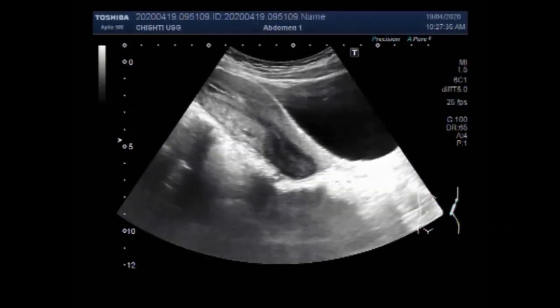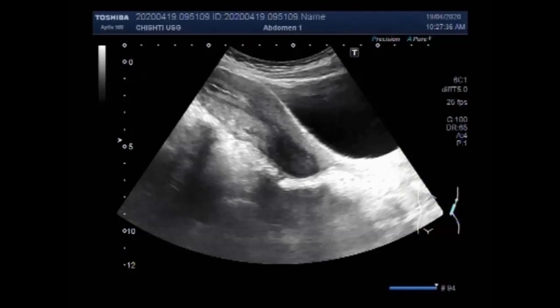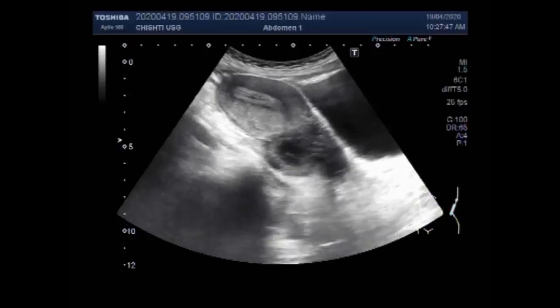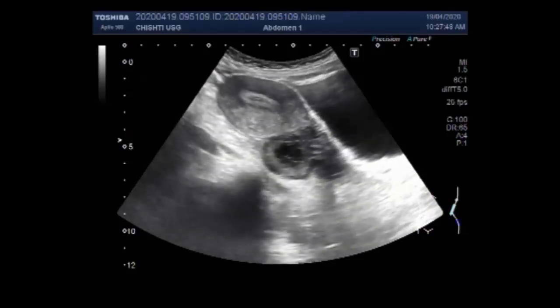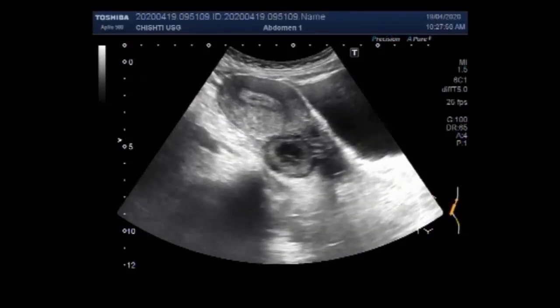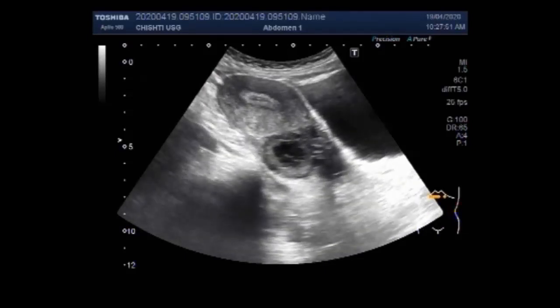Dear viewers, I hope you are all fine. This ultrasound video shows multiple cysts, simple cysts, hemorrhagic ovarian cysts, and an ovarian mass.